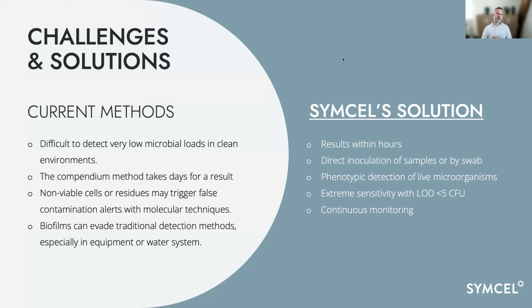Then we have also discussed the possibility of biofilm contaminations in either the equipment they're using or water systems, and that sometimes the cells in biofilms can be viable but not culturable by traditional techniques of plating or broth techniques.